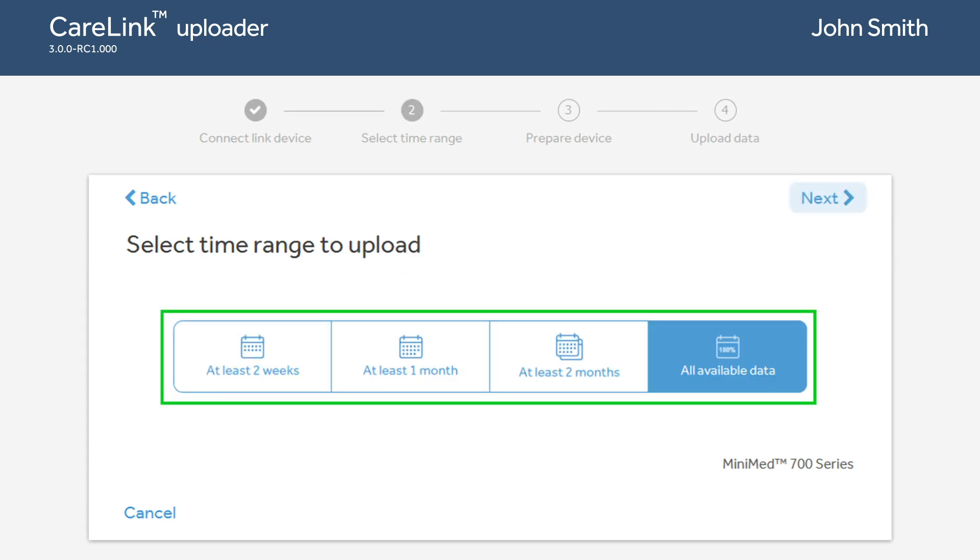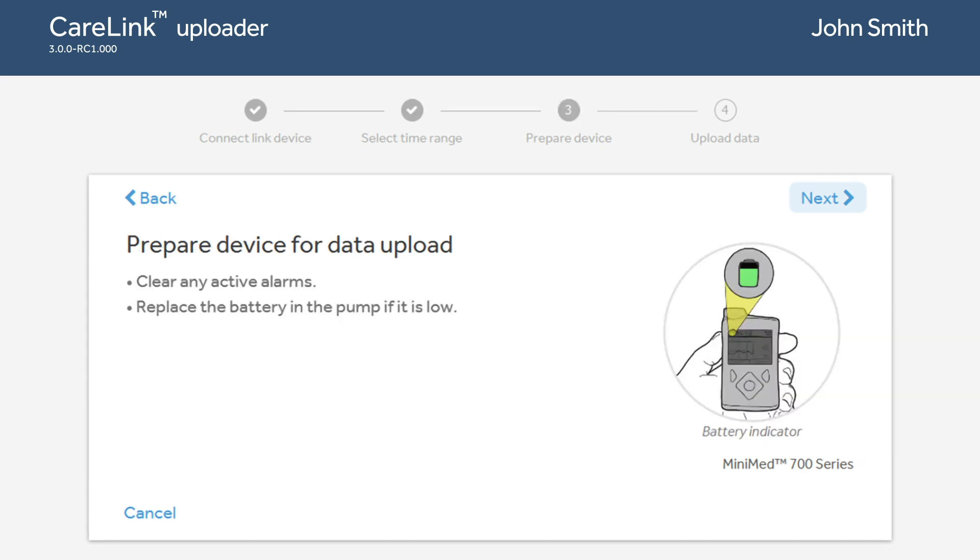Select the time range for the data upload. A longer time range may take longer to upload. Make sure your device is prepared for the upload. Clear any active alarms and put in a new battery if it is running low.